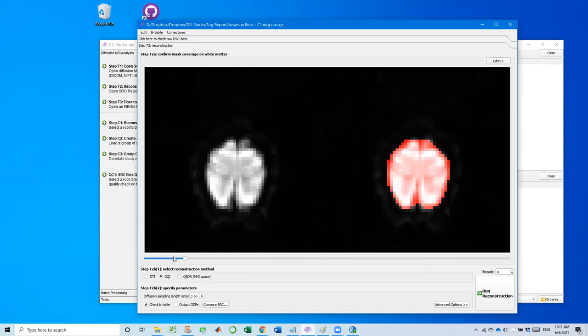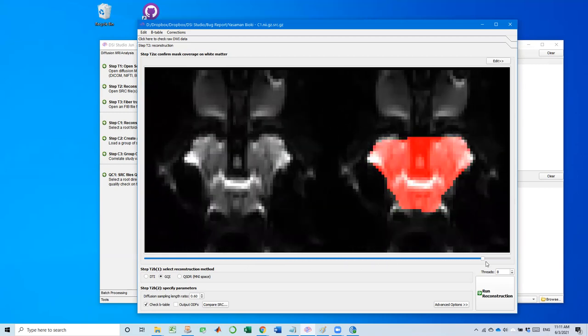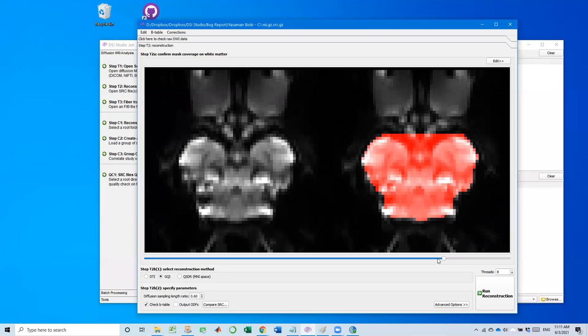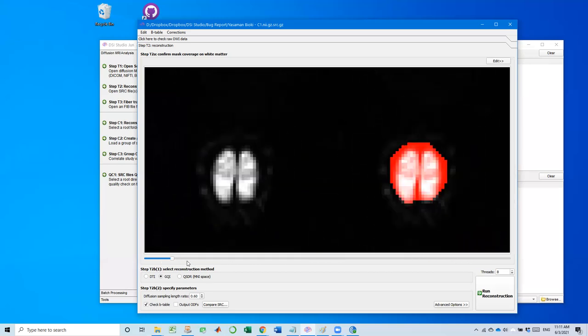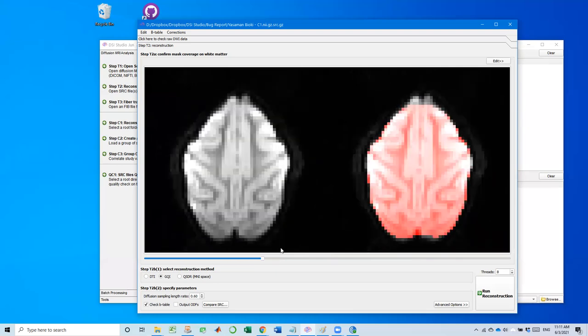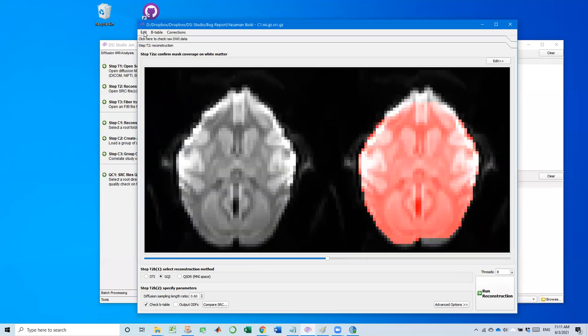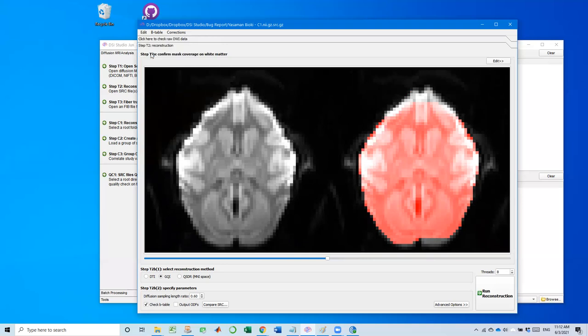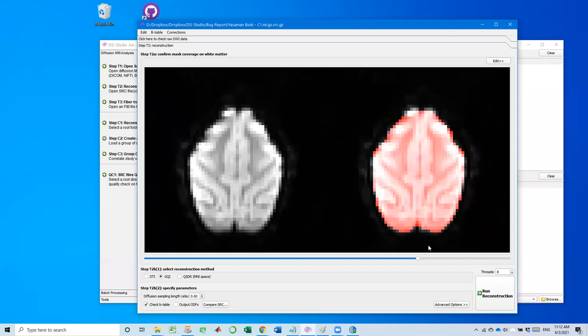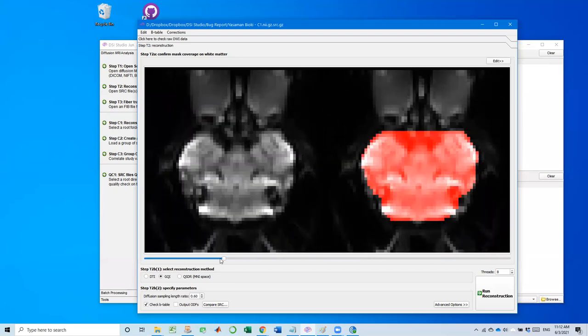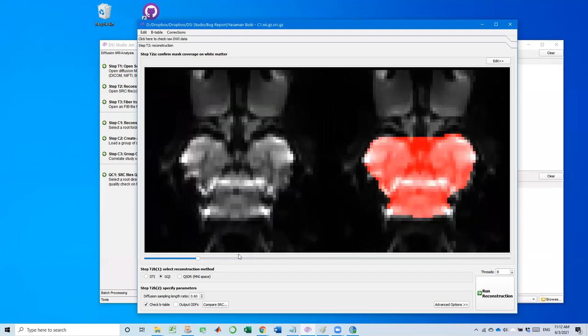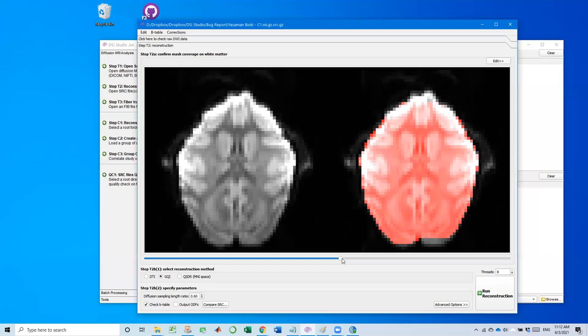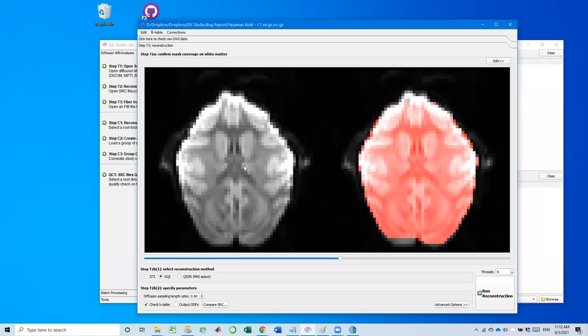Now the anterior side goes to the top and then we flip it to make the mirror image back to the original image. But when we go to the left side, we see this is top of the monkey brain and this is the bottom. So we also need to fix another image dimension problem here. Right now it's upside down, I would say. So the way we could do it is flip in the Z. So it's now upside down will be fixed. So once you click it, on the right, it's now the top of the brain. And then go to the left, it will be the bottom of the brain. So it's now in the right orientation. But as I mentioned, once we click a flip or swap, this is a mirror image. So to mirror it back, here we could just go flip X.